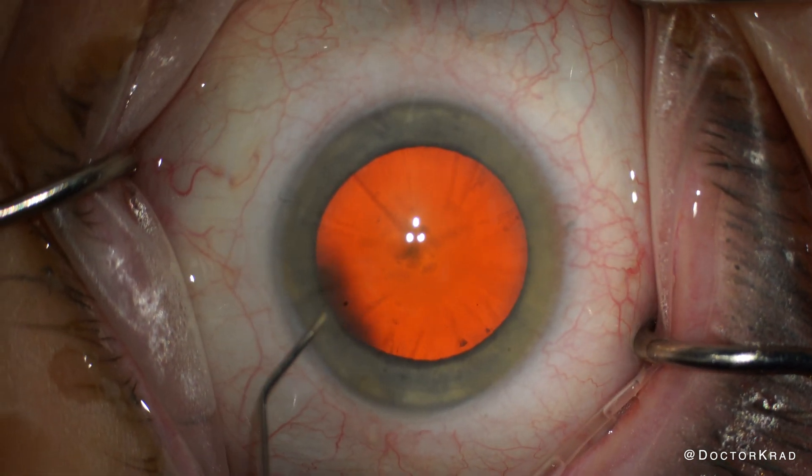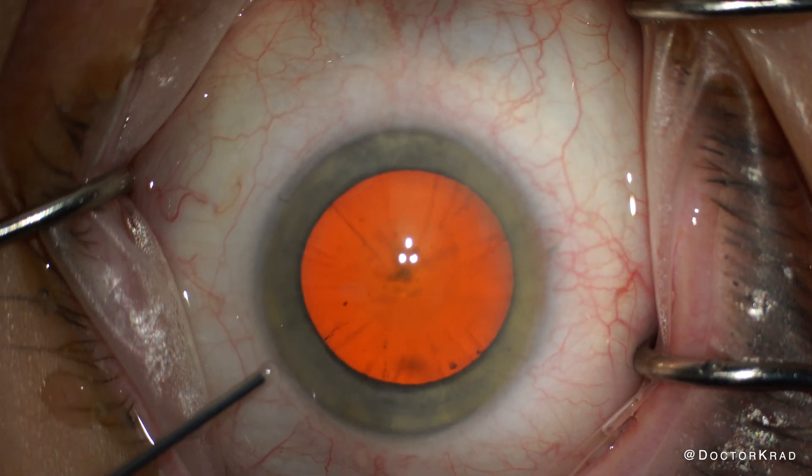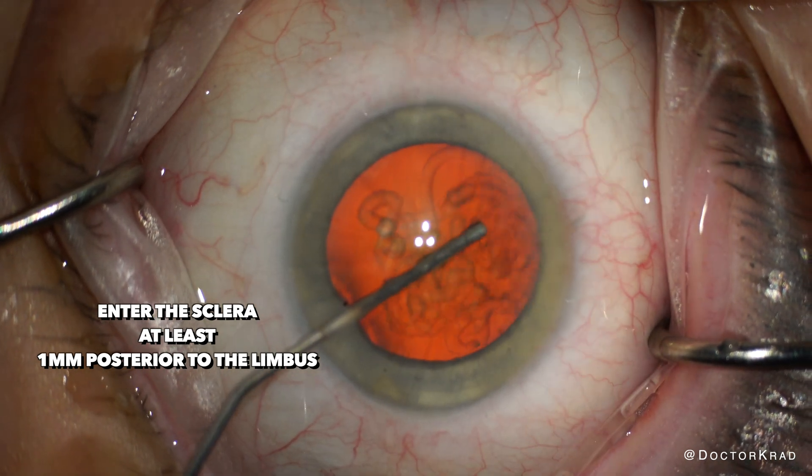So I plan to go through the sclera. There needs to be a lip of sclera between my main incision and the RK cuts. The lip of the sclera, or the tunnel length, should be at least 1mm.